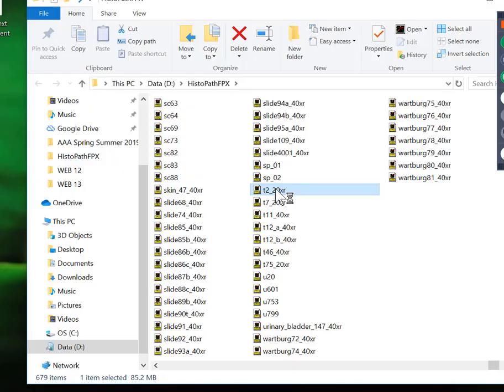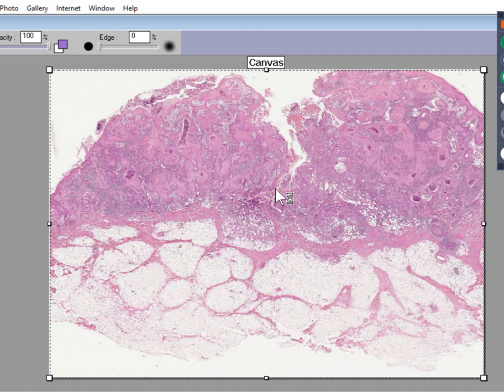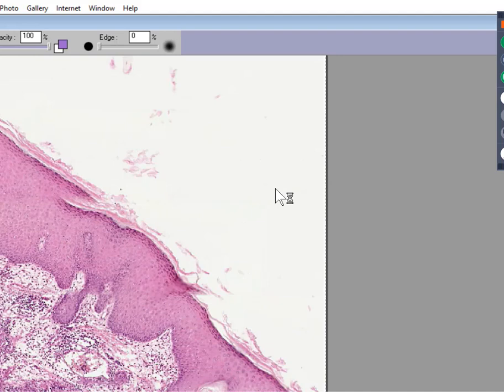Okay, and I bet that you're getting better at this. I bet you're getting very good at this. And I think what you could recognize here is something blue and pink on the top, and then very white and washed out on the bottom, like maybe it's fat. So you're looking at something that has fat on the bottom and some type of thick nodular tumor on the top. And if you don't know what this is yet, I'm going to give you a little sneak preview here of going to the extreme northeast again and showing you something that you should have known by now.